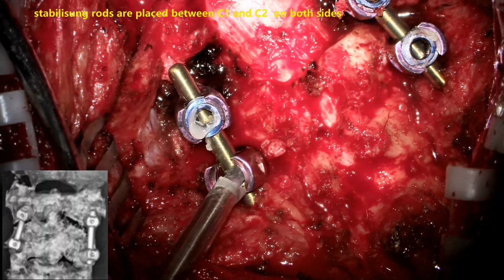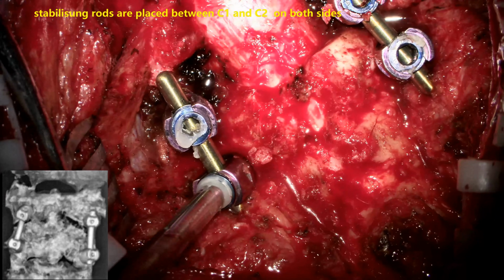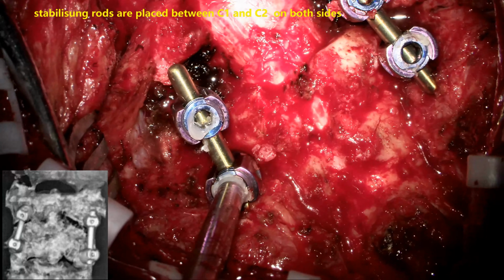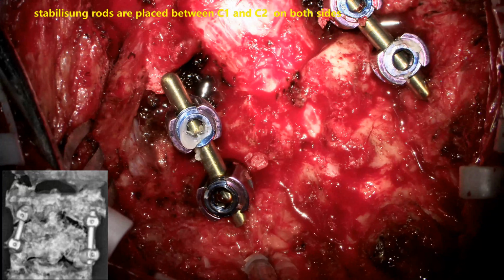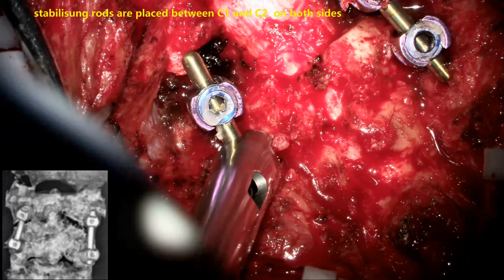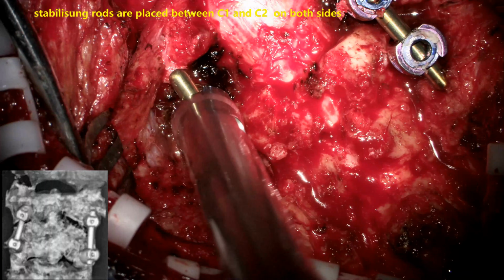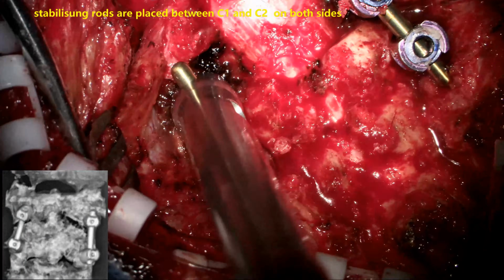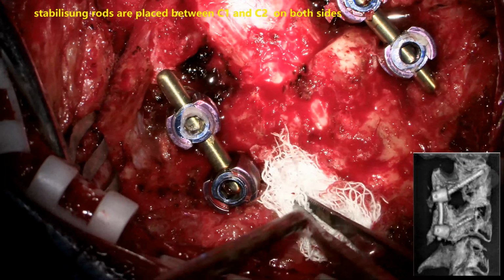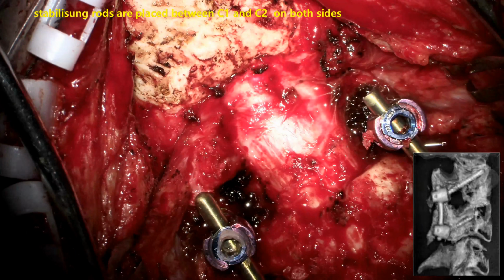This is the lower part of the screw, and again these are done under high illumination and high magnification without causing mobility during the insertion of the screws. The screw head stabilizer is brought in and the screw is tightened, and both superior and inferior screws are tightened as shown here. And you see the screws here inside the bodies are going to be very delicate, so mobility during the tightening needs to be prevented.